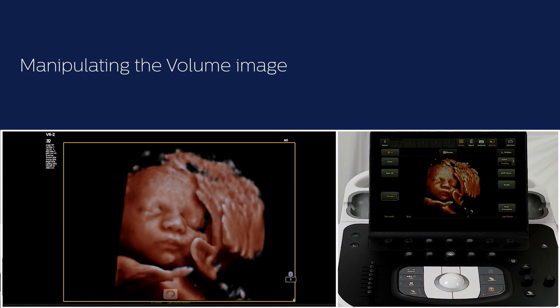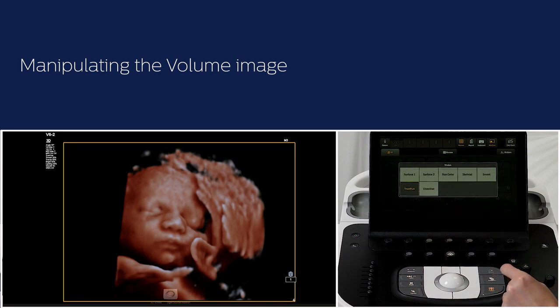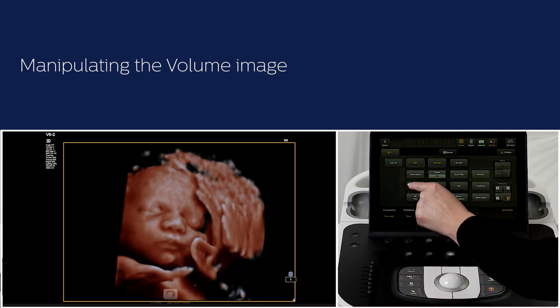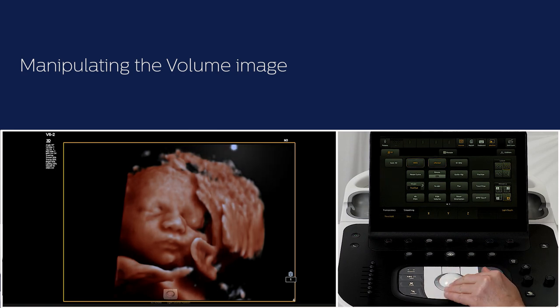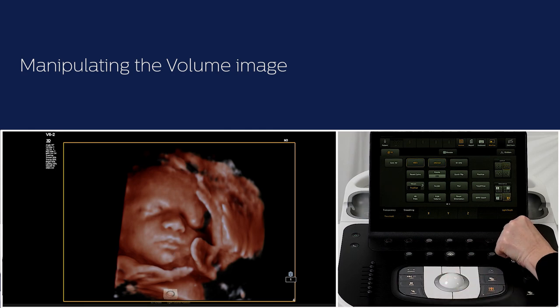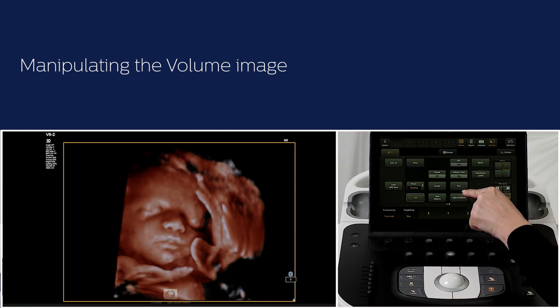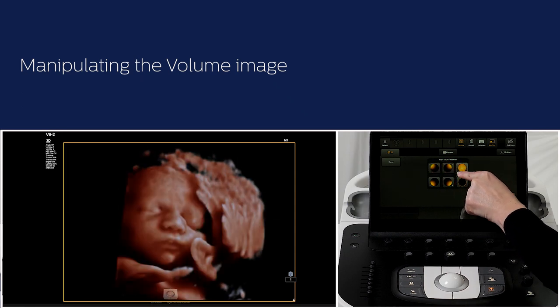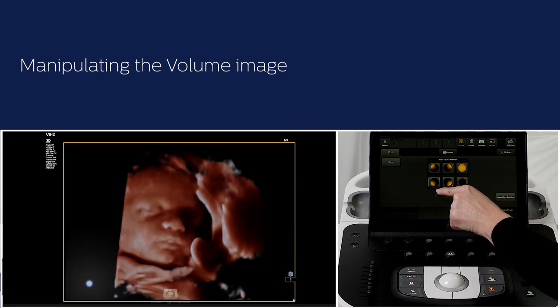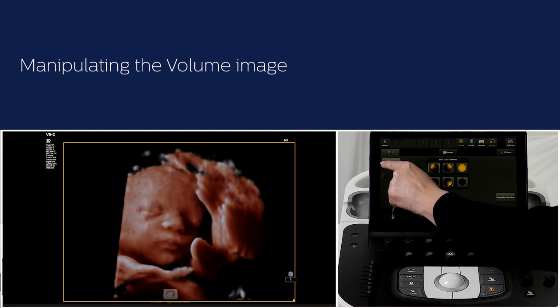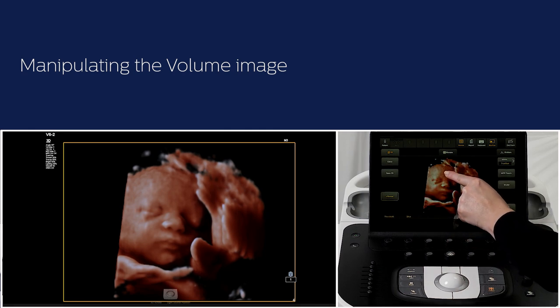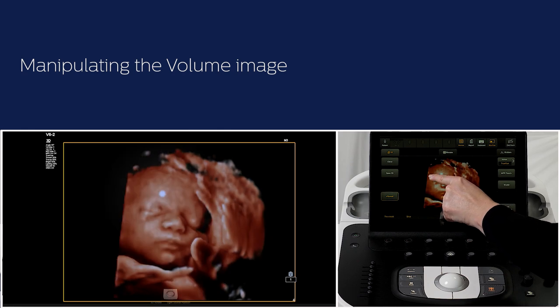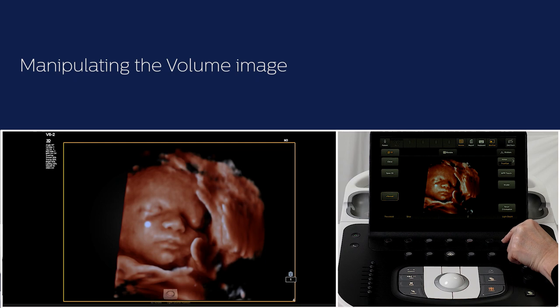Different rendering options are available for the volume image. Press vision on the touch screen to see different options. The true view vision or rendering has a light source that can be moved using the trackball around the volume image and in depth through the volume by turning the rotary knob. On the second page of the touch screen, press light positions. You can choose from different positions for the light source. The volume image should be the active plane to adjust the light source with the trackball. Touch view can also be used to manipulate the volume image and the light source on the touch screen. Tap once on the touch screen and then move the light around. Turn the rotary knob to change the light depth.